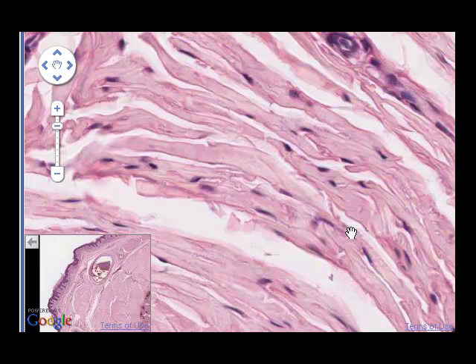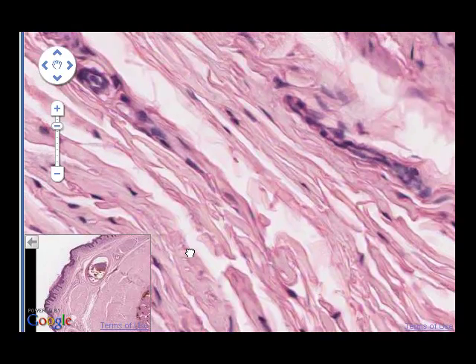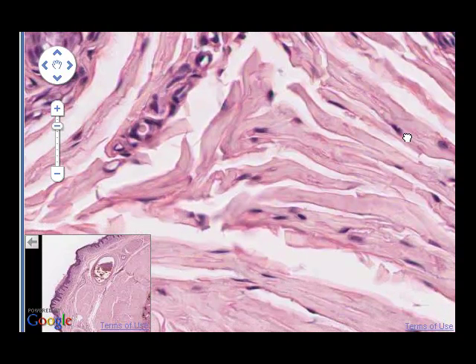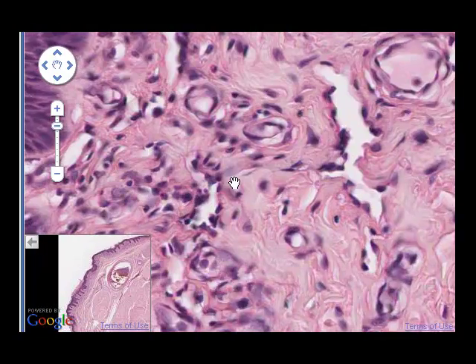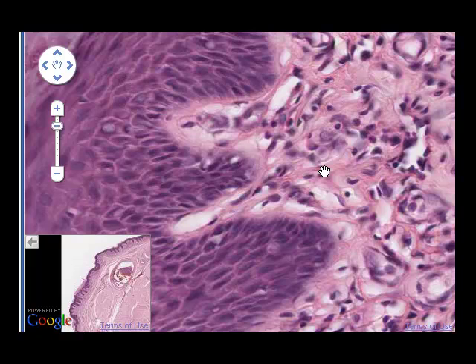So here again a classic example of dense or moderately dense irregular connective tissue, big plates or bundles of collagen fibers, predominantly collagen type 1, cell nuclei which are mainly those of fibroblasts. There are occasional blood vessels, as in here and here, but not as highly vascular or as highly cellular as, for example, here where we see blood vessel after blood vessel, and a lot of cells and cell nuclei found just beneath the epidermis.